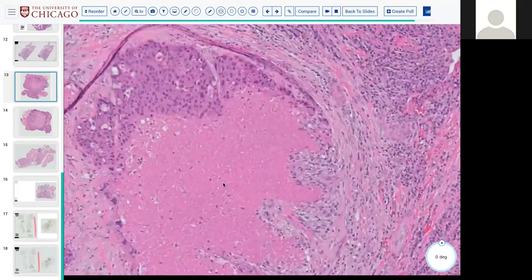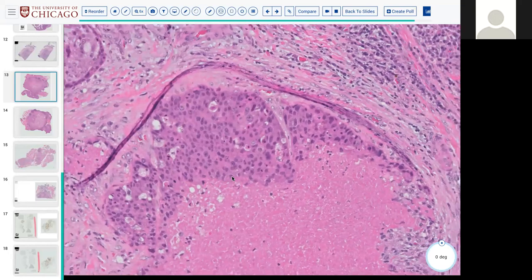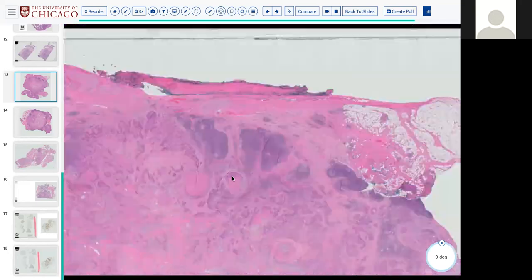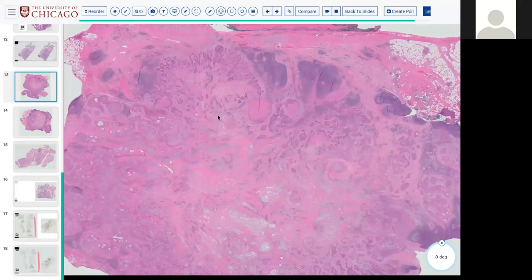Anyways, I looked at the central necrosis and I was thinking, this looks like invasive ductal carcinoma a little bit, so that's kind of how it got me thinking. I do understand that there's low grade and high grade, but it did enter my mind. That's why I'm asking. Got it.